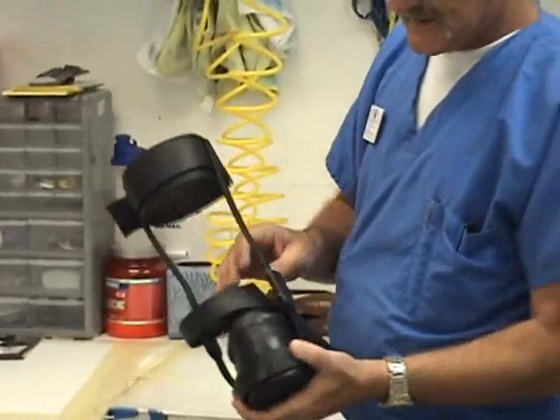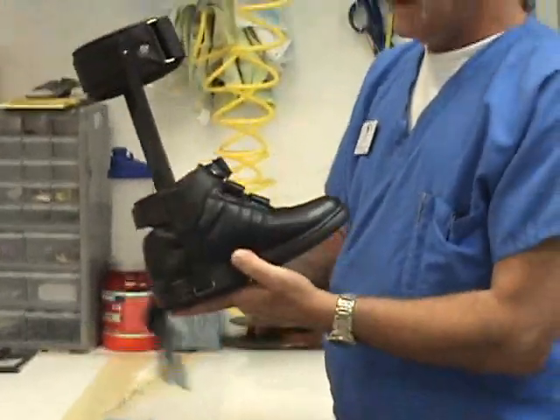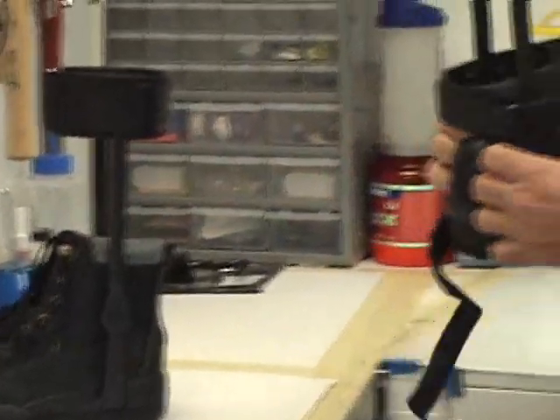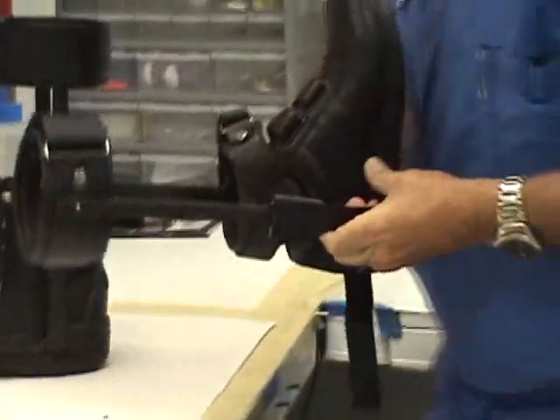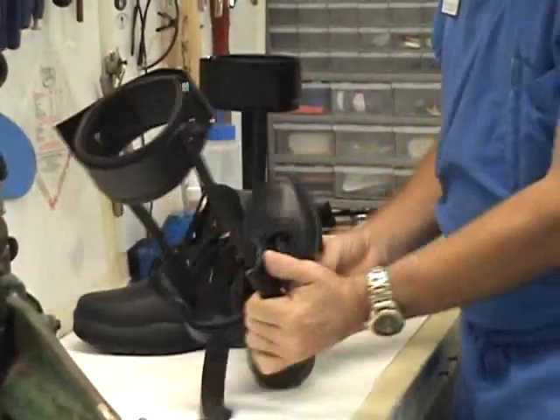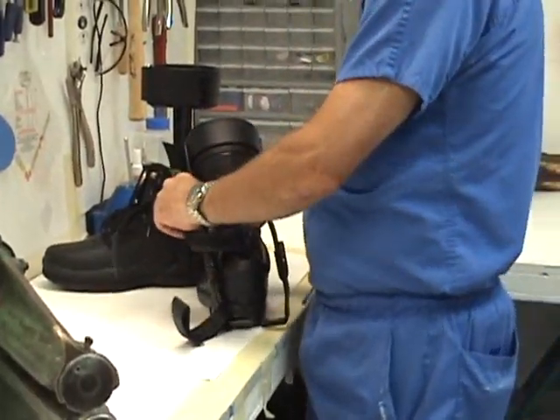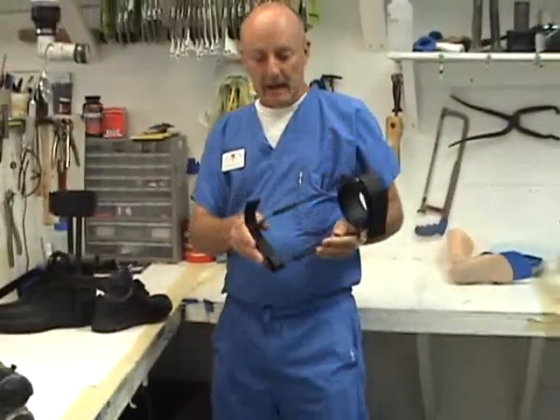This particular design here is a split caliper design. What's good about that is with the standard design, you're stuck with one shoe — it is mounted to the shoe and fixed forever. With the split caliper, you can actually have the caliper plate mounted to the shoe and have more than one shoe. Once I undo the T-strap here, the brace is transferable from shoe to shoe.